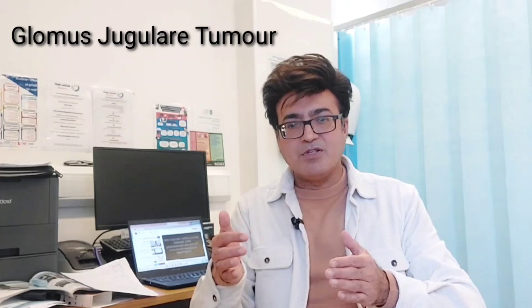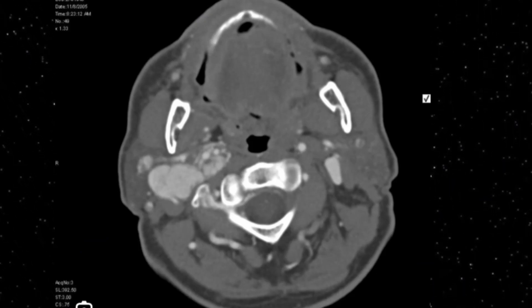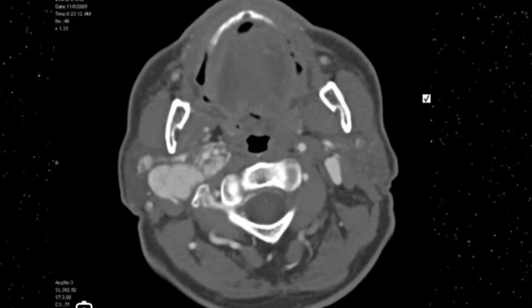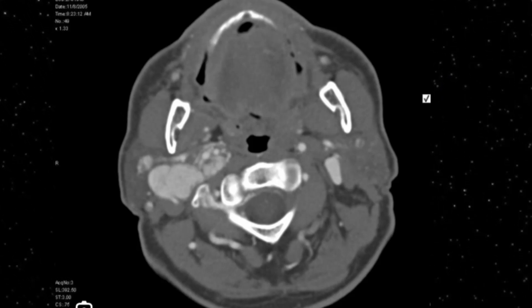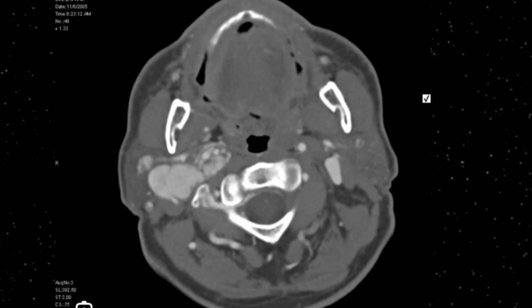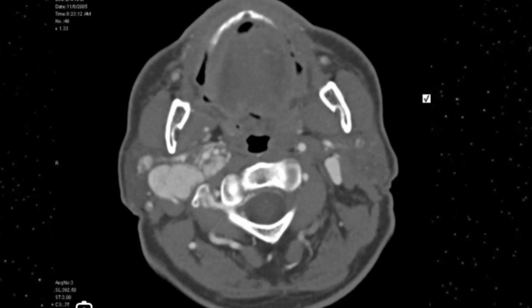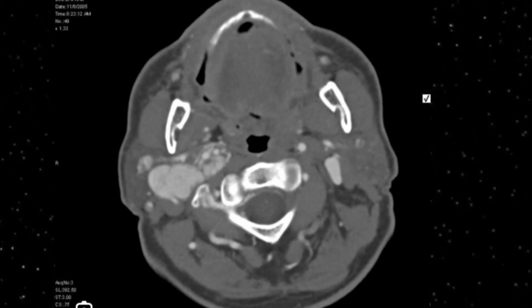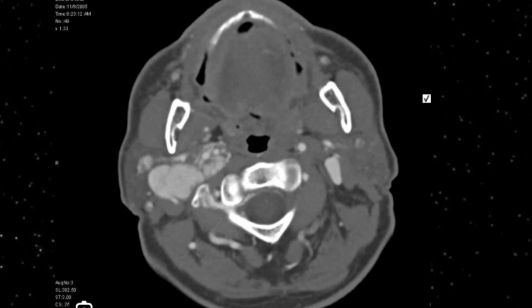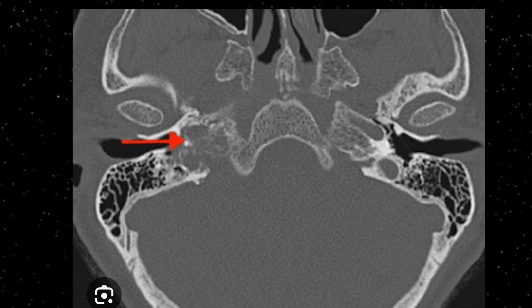Let's start looking at these images. On this axial image you can appreciate that this is the glomus jugulare tumor on the right side, arising from the paraganglionic cell. You will be able to see the moth-eaten bone destruction and also enlargement of the pars vascularis of the jugular foramen. These two findings make the diagnosis of glomus jugulare tumor clear.